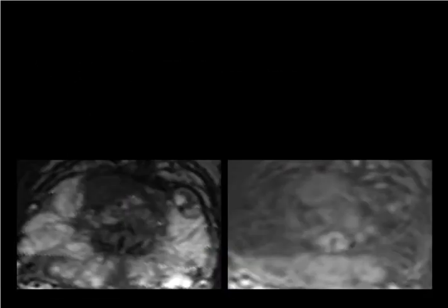So bringing these modalities all back together, we have the MRI images, and if we were, for example, looking to target biopsy towards the more aggressive foci, or if we were looking to do focal therapy, identifying targets on an MRI alone would be challenging. There's some evidence for cancer in the posterior wall, but there's no corroborating evidence from the diffusion contrast image. And this anterior focus is really subtle and would be really challenging to identify on either modality.